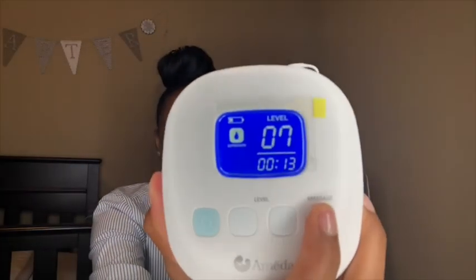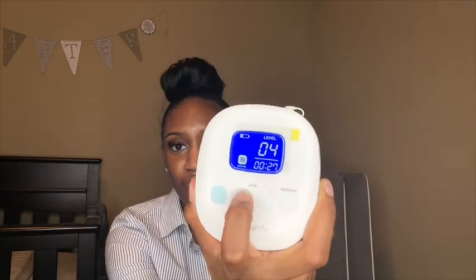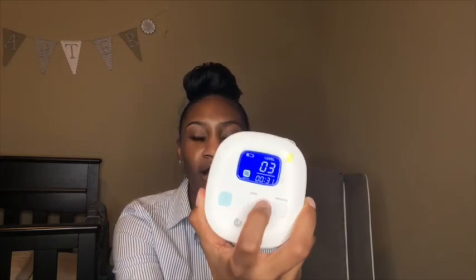There are two modes: there is a massage mode, which you use to stimulate let-down, and then there's an expression mode, which you use to express the milk into the bottle. There are five levels for massage mode, and ten levels for expression mode. I really like this pump because with expression mode you can feel the pump trying to express that milk out of your breast, and that's awesome because I'm trying to get every little drop. I stay on level seven for expression mode.